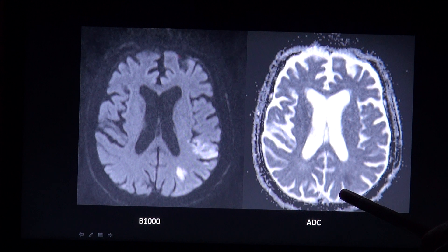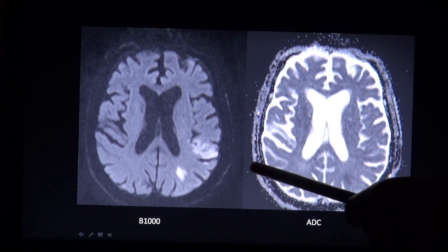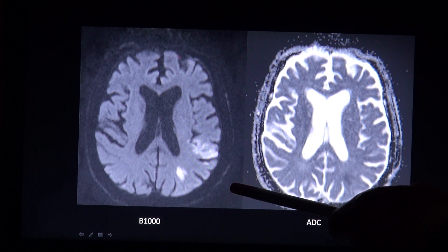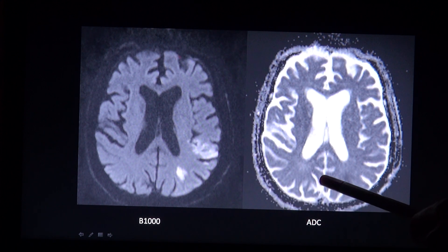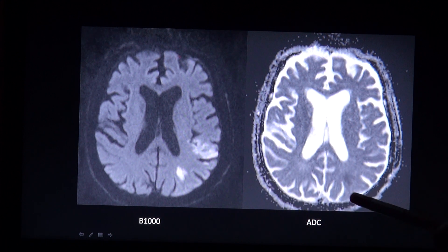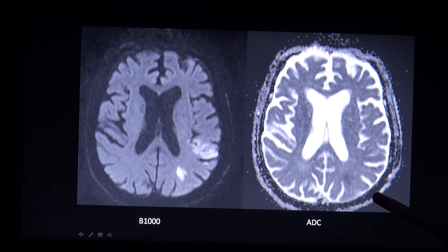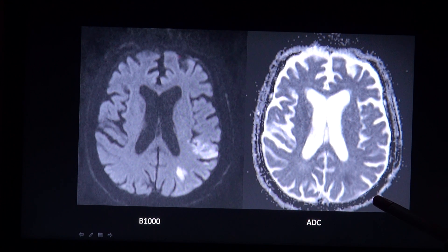Sometimes you can see a bright lesion on the B1000 image which is also bright on the ADC map. This is referred to as the T2 shine-through effect and does not equal a cytotoxic edema.